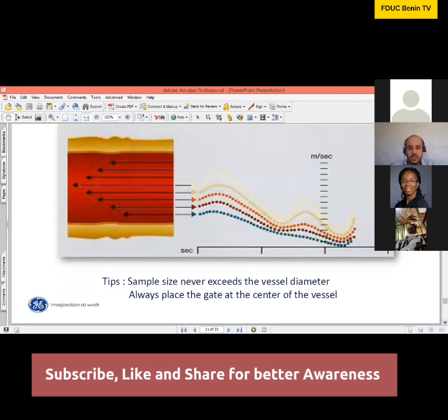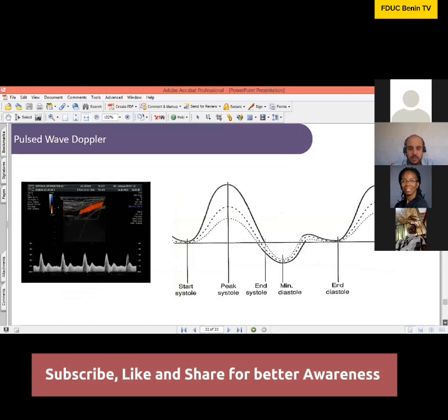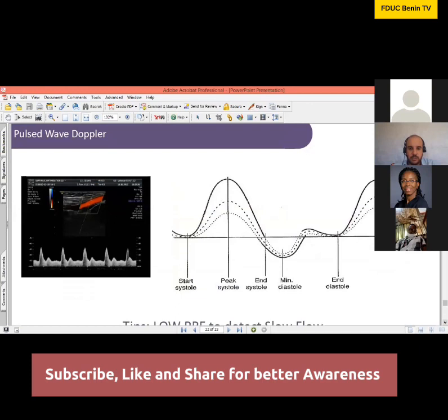Why? Because as you can see on this graph, it's at the center where we have the highest speed. So that's why we should focus on the center of the vessel to place our sample for the pulsed wave Doppler.